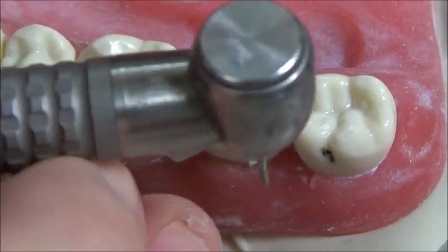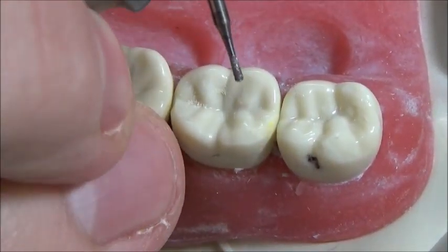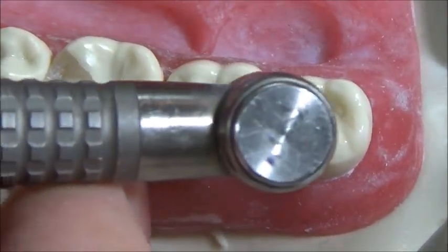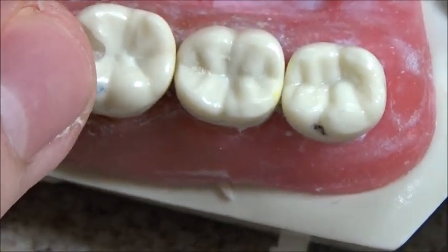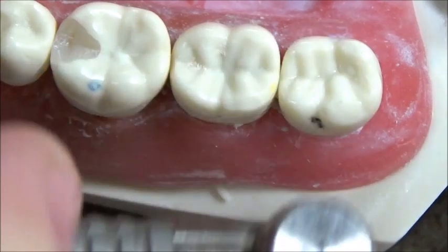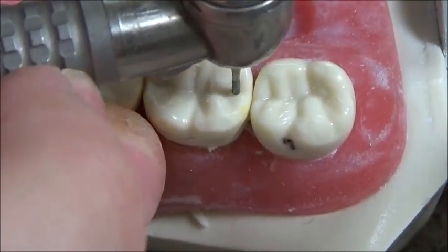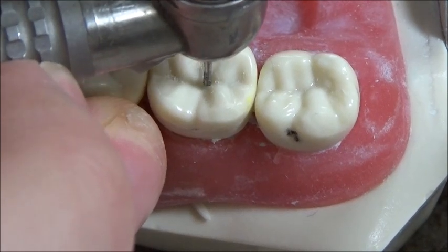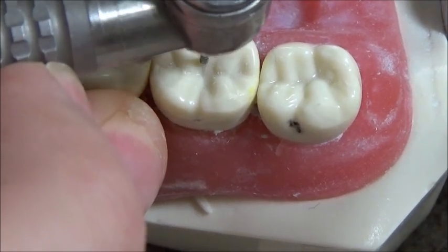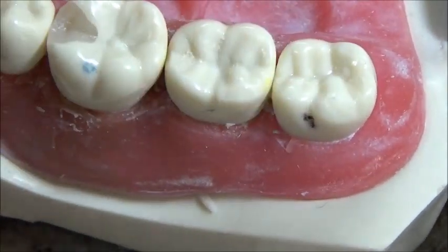I'm going to demonstrate with a 330 burr — it's an inverted pear — on tooth number 18, for a class 1. For a class 1 filling, you'll essentially be following the grooves of the teeth. You'll want to go to a depth of about 1.5 and an isthmus width of about 1 to 1.5.